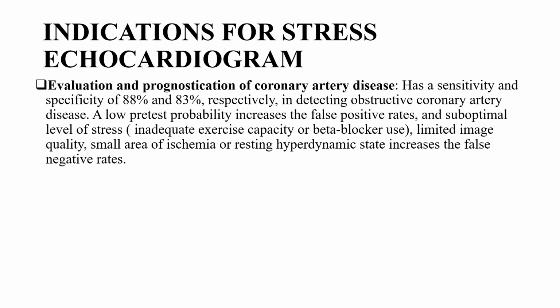Now, it relies a lot on good image quality. You need to see your endocardial border clearly. You need to be able to appreciate the thickening and the inward movement on the echocardiogram. And it also requires that the person be able to achieve an adequate heart rate to induce enough workload on the heart to elicit a positive test. If you have a suboptimal stress, then you are likely going to increase your risk of a false negative report.